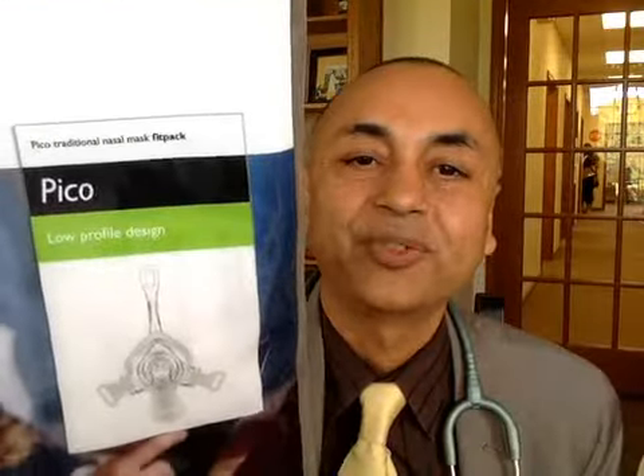Hello there, I'm Dr. Patel and I want to talk to you about the new Pico from Philips Respironics, a minimal contact nasal mask with headgear. We have had several patients who have tried it and had nice things to say, but I'll tell you about what it looks like and what its features are.